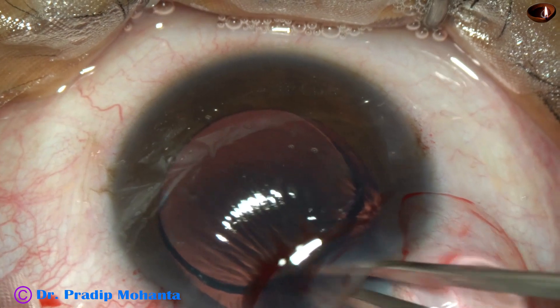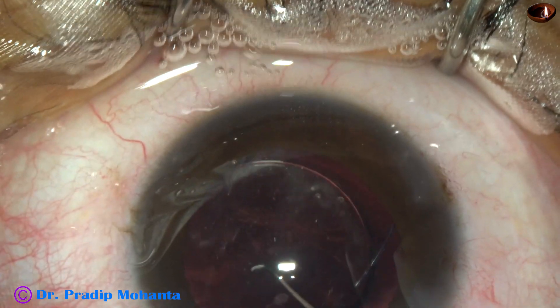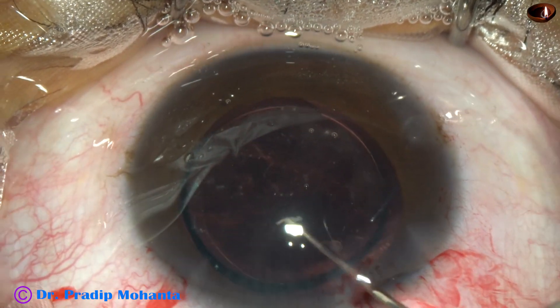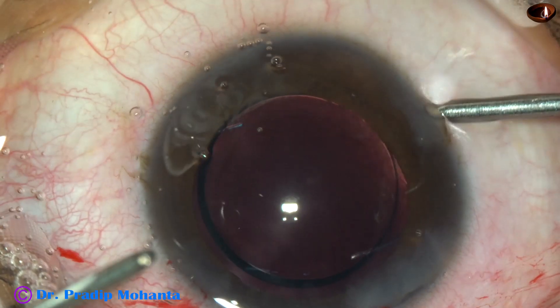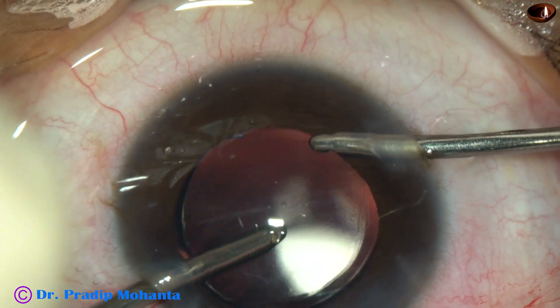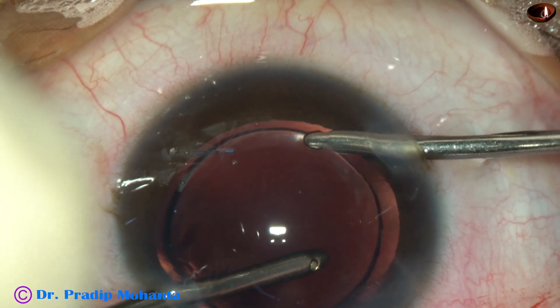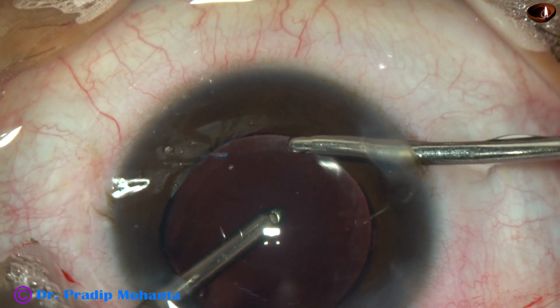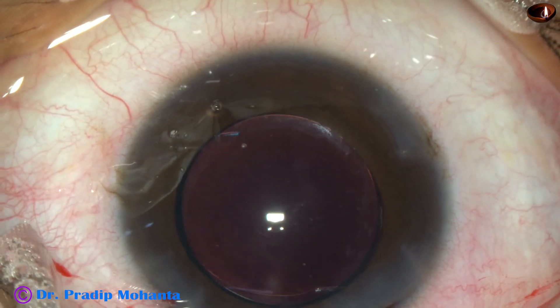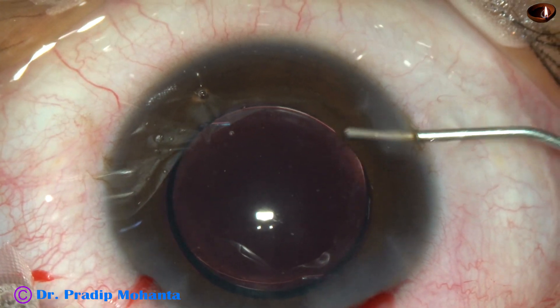And now, here it is. With the help of McPherson's forceps, the trailing haptic goes into the capsular bag. Now this viscoelastic substance has been irrigated out, first by Simcoe and then by the irrigating probe of bimanual I/A. And this is the final lavage for removal of viscoelastic substance. Then the side ports are closed by hydrating the corneal stroma on either side of the stab wounds.